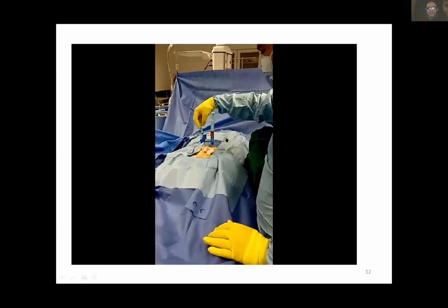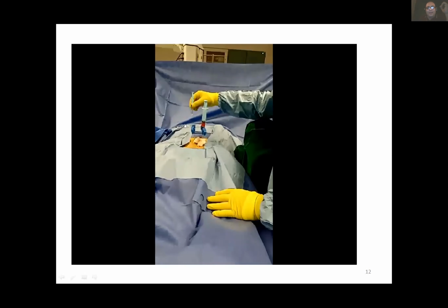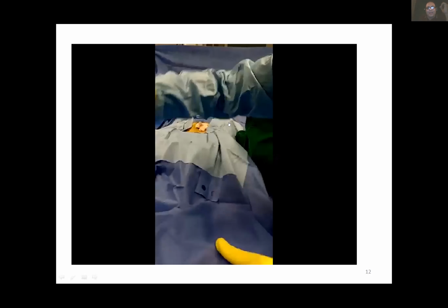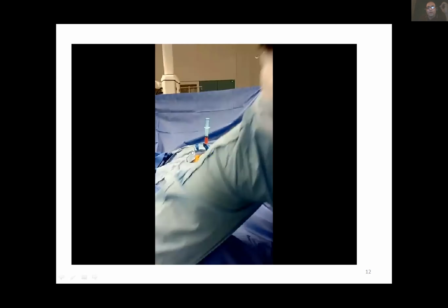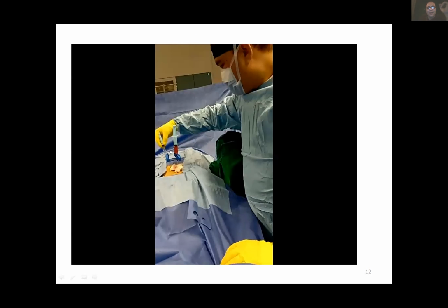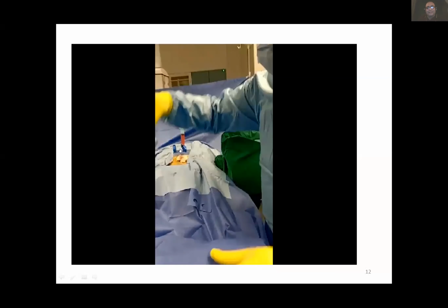Here, this is one of my cases where I used a double pedicular approach, and you can put the needle and inject saline, and you can take this saline for culture and sensitivity and histopathology. This saline removes the debris. The saline, if it is cold, can create a little vasoconstriction. By this means, you decrease the incidence of cement leak.